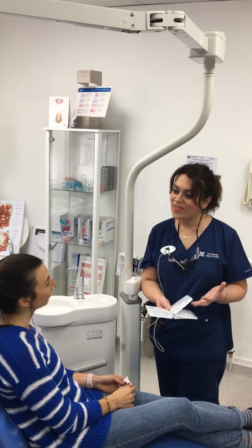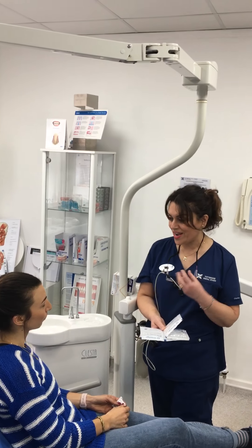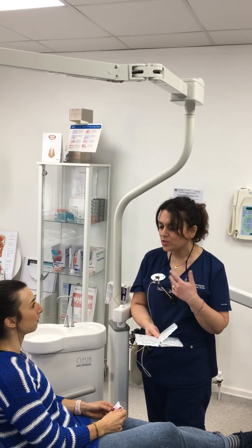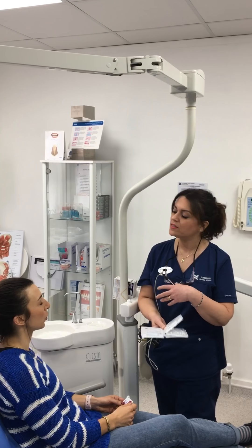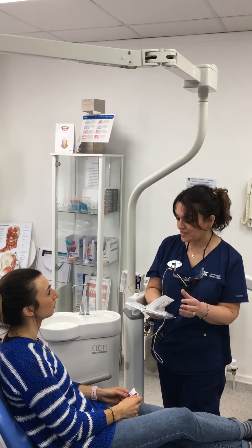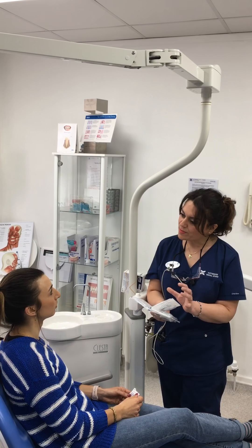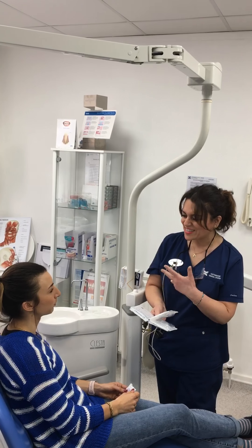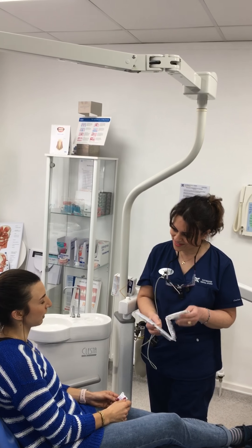Also, when you initially wear them, you might feel your phonetics is affected — you might sound a bit muffled on the phone. But you will soon adjust to it, because the tongue is a big muscle, a very clever muscle. When there's a limited amount of space in your mouth, the tongue actually adjusts to that space, so it takes a bit of time but you will adjust.